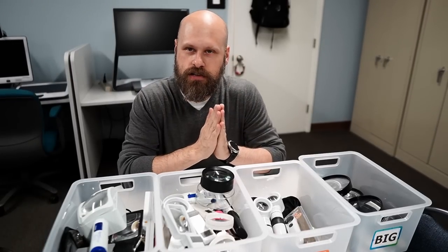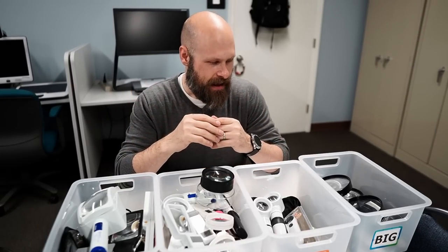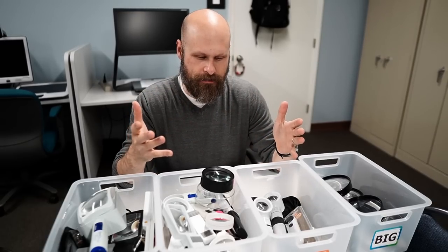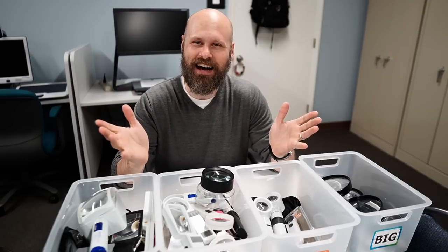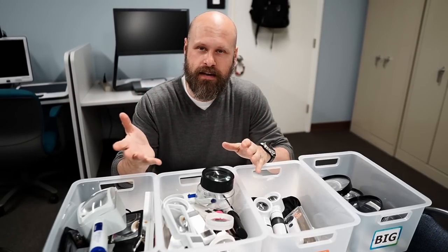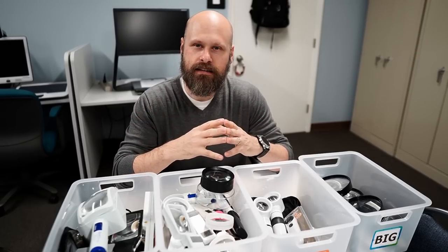I recently got a question about magnifiers from a viewer asking for a little bit of information about them and which would be the best one for them. And the thing about magnifiers is there's an infinite number of different kinds. So if you are trying to decide which magnifier to get and what's going to be the best one for you, there are a couple of things you need to take into consideration.